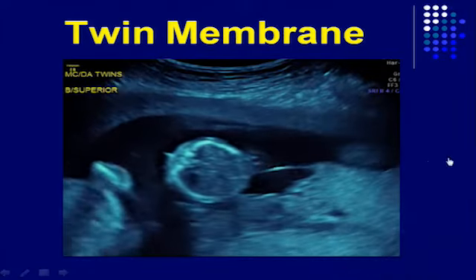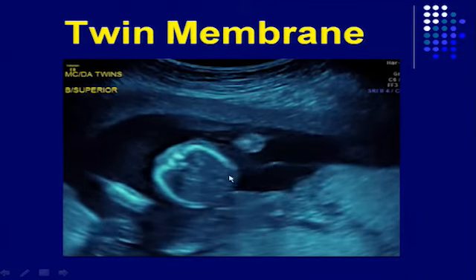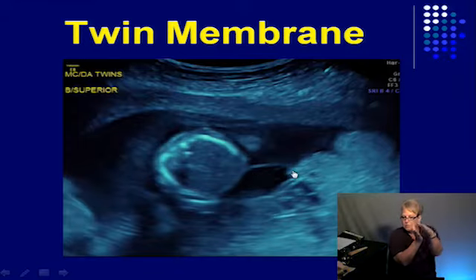Look at this. They said this baby had normal fluid. This is that baby's membrane there, and it looks thicker. Do you know why it looks thicker? Because it's membrane on membrane. This baby had no fluid around it, so that baby's membrane is just kind of stuck together.